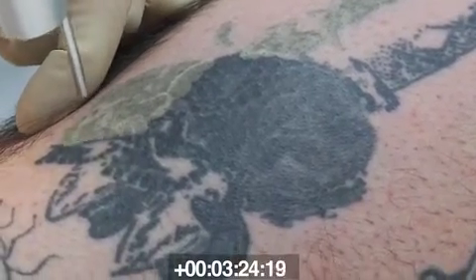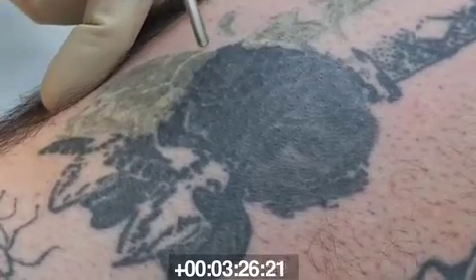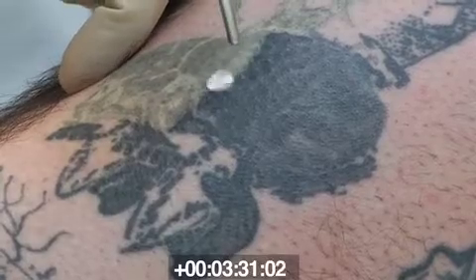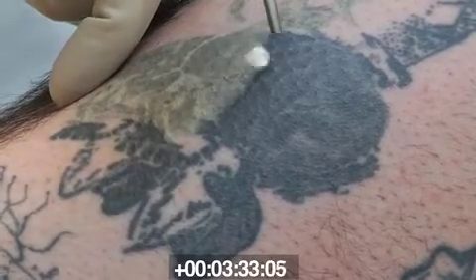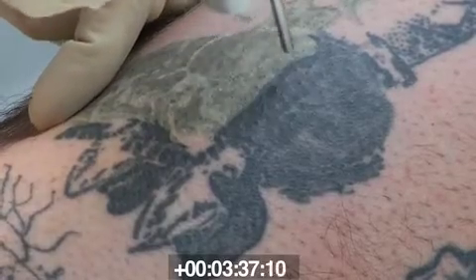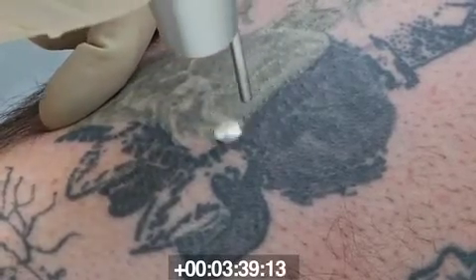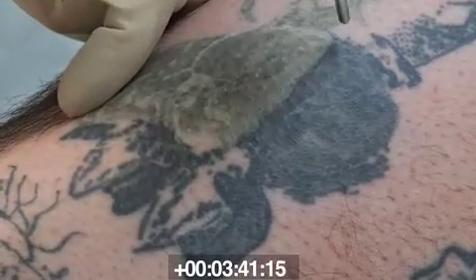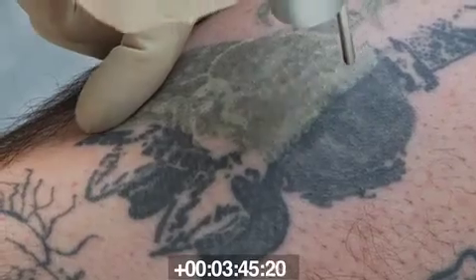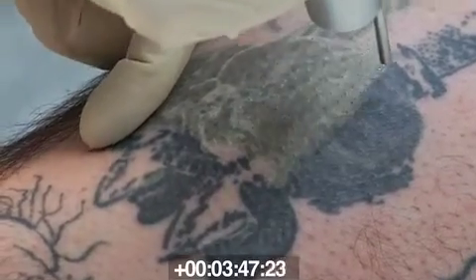Excellent. We apply topical anesthetic to these for 30 minutes prior to treatment with a combination of benzocaine, lidocaine, and tetracaine. And that does help take some of the sting out of the treatments, but all patients invariably feel discomfort with tattoo removal. They usually report that it feels about 10 times more uncomfortable to get one removed than to have it placed.